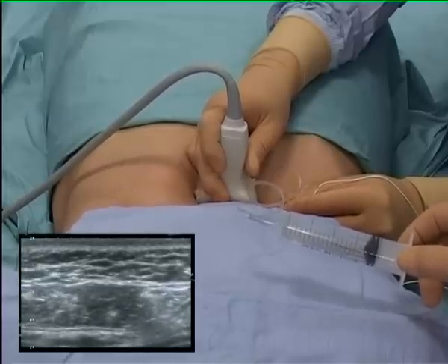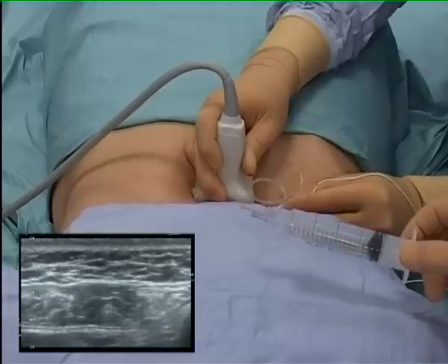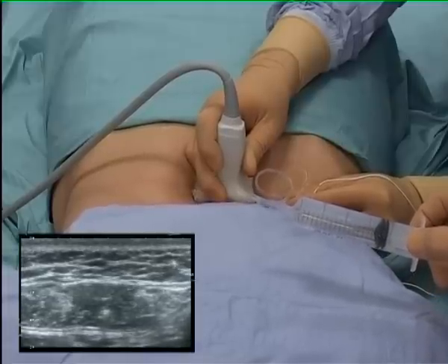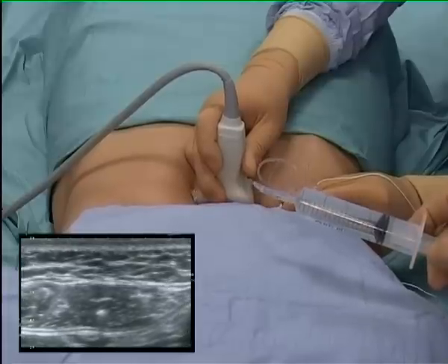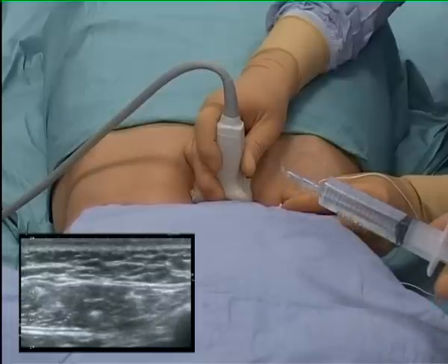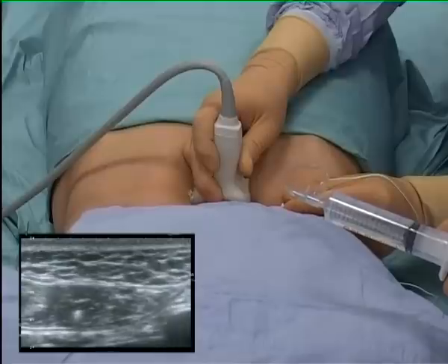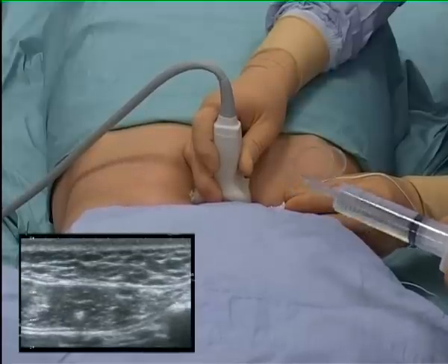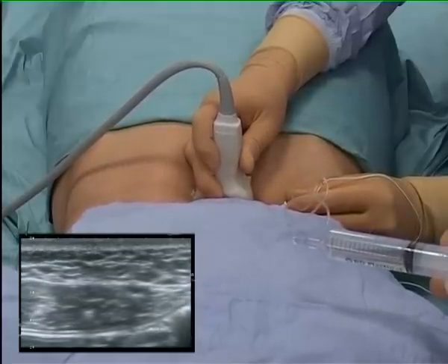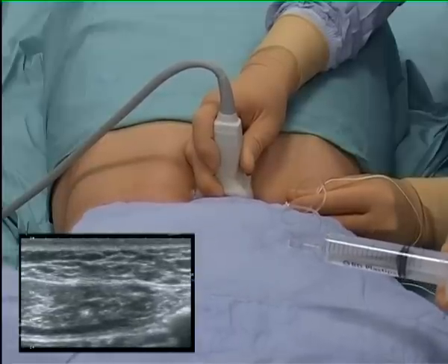The local anesthetic is injected, and can be seen to cover the complete posterior aspect of the muscle.